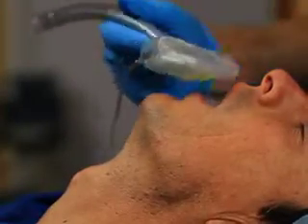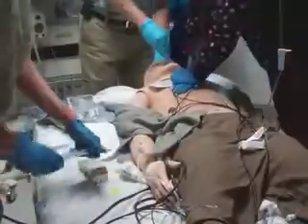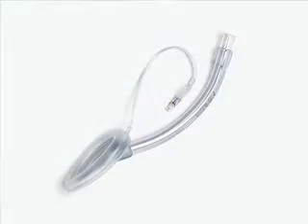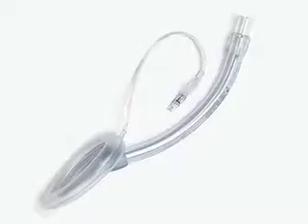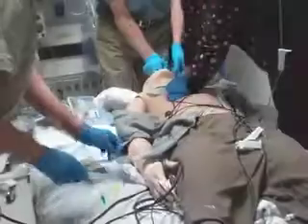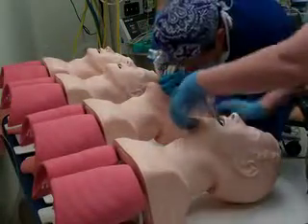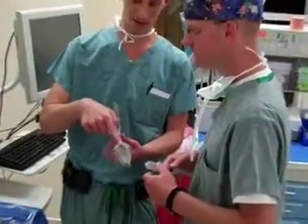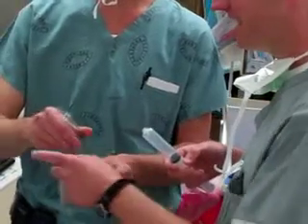This video will demonstrate the placement of the laryngeal mask airway, or LMA, as an emergency airway device in patients experiencing a cardiopulmonary arrest. The goal is to provide familiarity with and instruction in its use so that a clinician will be comfortable using this device to provide effective ventilation for patients in cardiopulmonary arrest. Instruction beyond this video is necessary for safe and effective placement of a laryngeal mask airway, and the clinician should seek further training from anesthesiologists or others who have expertise in its use.